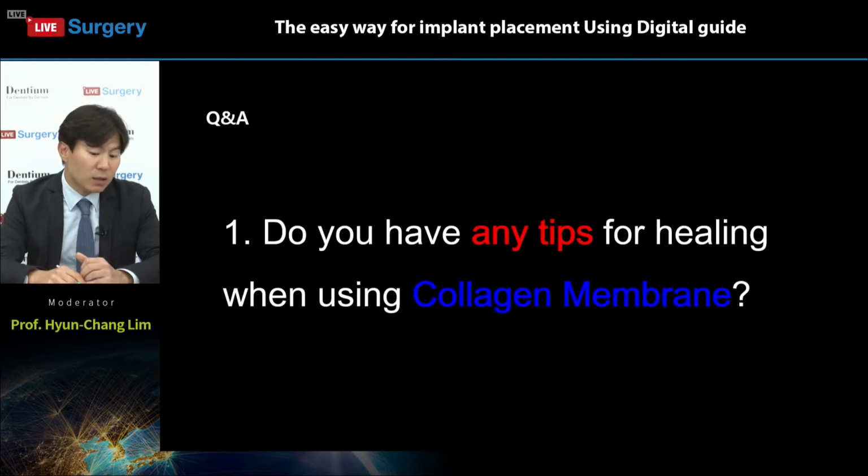In that case, I think the non-submerged type healing with bone level implant is okay. And the collagen membrane is very durable and can be maintained under the flap. So after the sufficient healing period, the membrane is still working, and under the area of the membrane, we can expect a nice regenerated bone.